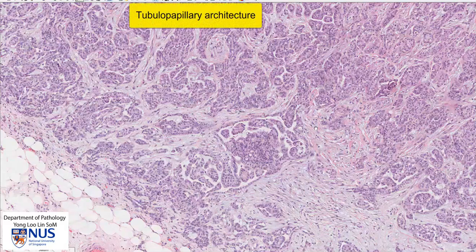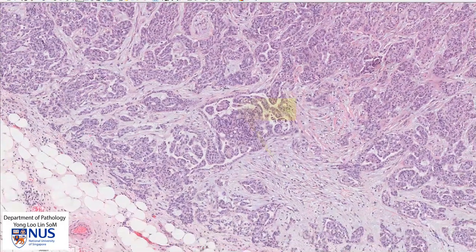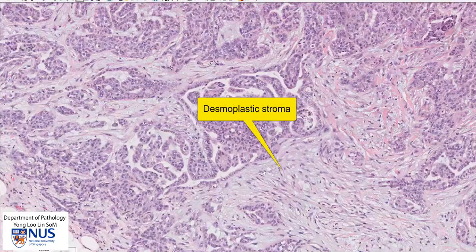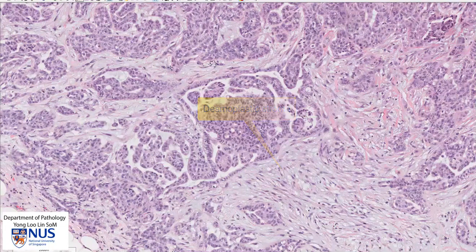We can also see that the surrounding stroma is very desmoplastic. It is cellular and there is this proliferation of plump spindle cells, which are the myofibroblasts in the stroma. There are also a few scattered inflammatory cells in the stroma.